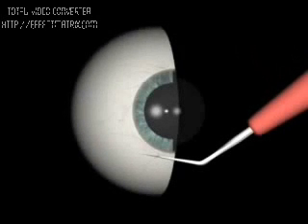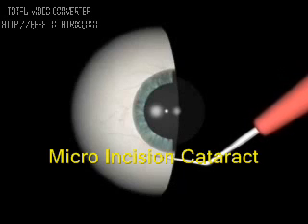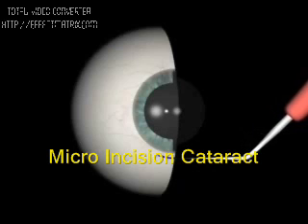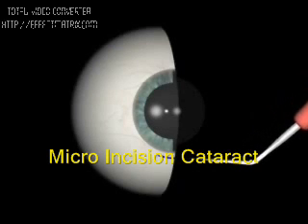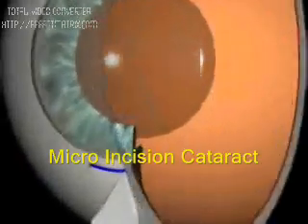Incision. Surgery begins with a self-sealing incision. In this case, a limbo-corneal incision. Using a crescent knife of 3.2 mm width, a perpendicular pre-cut is made at the limbus, followed by preparation of a corneal tunnel, and then entering the anterior chamber.